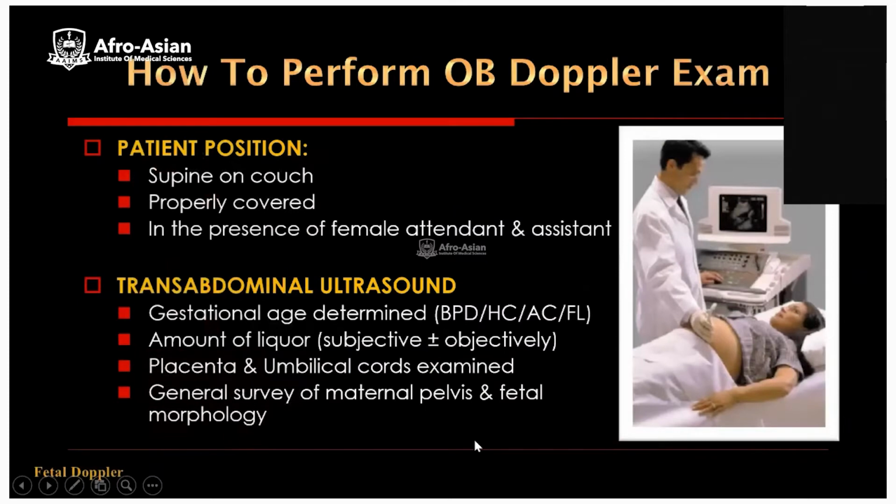How to perform obstetrical Doppler examination? The patient position: the patient is supine on the couch, properly covered, in the presence of a female attendant and or assistant, especially when a male sonographer or radiologist or gynecologist is scanning, transabdominal ultrasound.